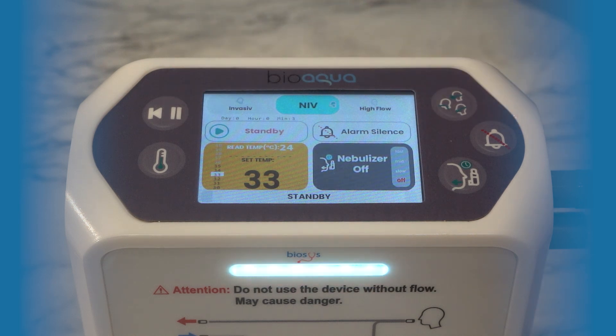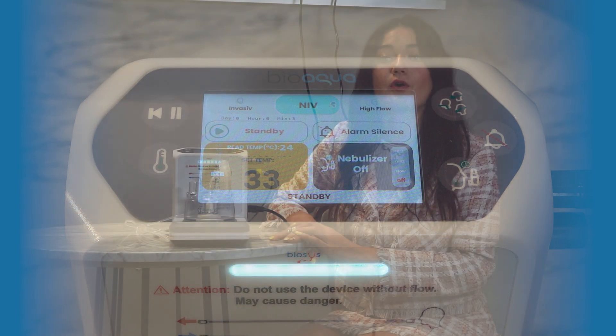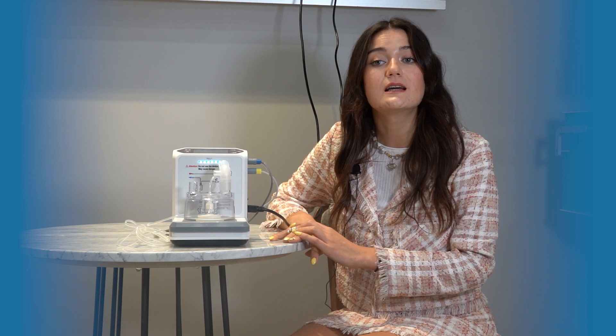All these functions can also be accessed via the touchscreen. The touchscreen allows for easy selection and visibility of parameters such as set temperature, measured temperature, and treatment duration, facilitating user operation.